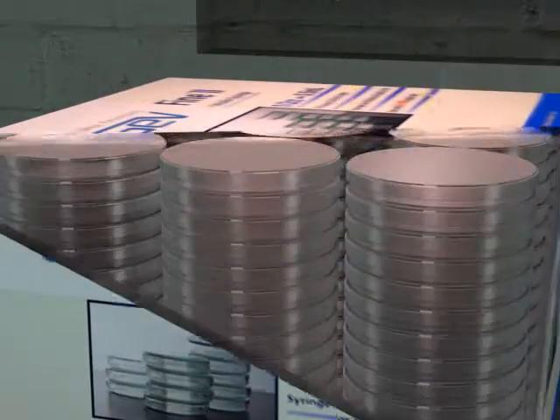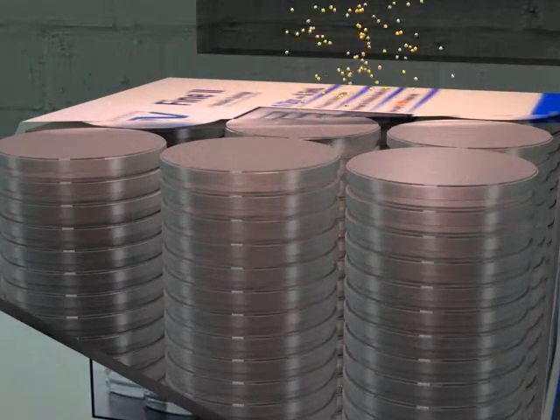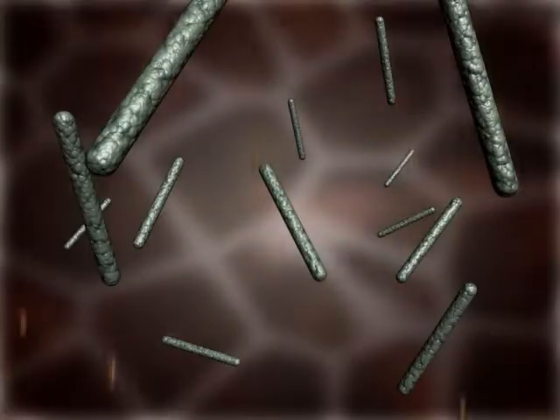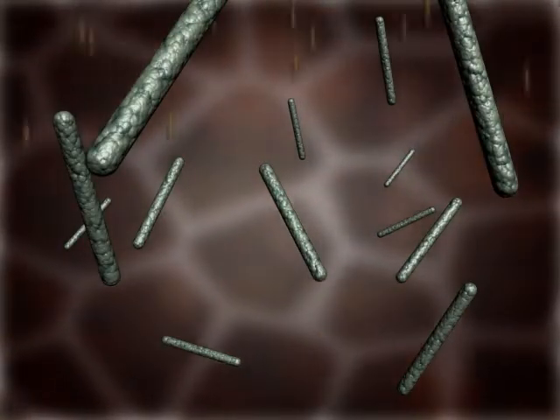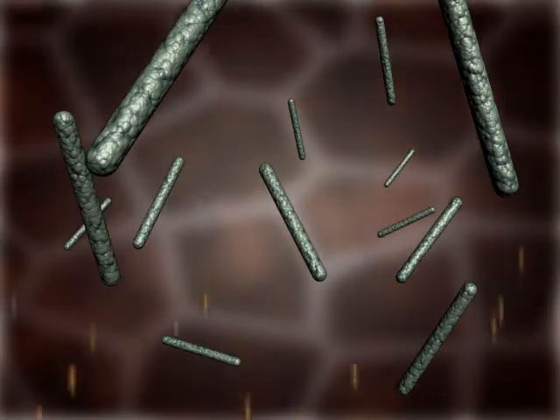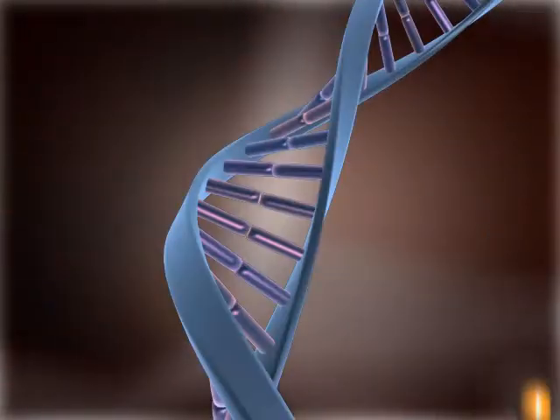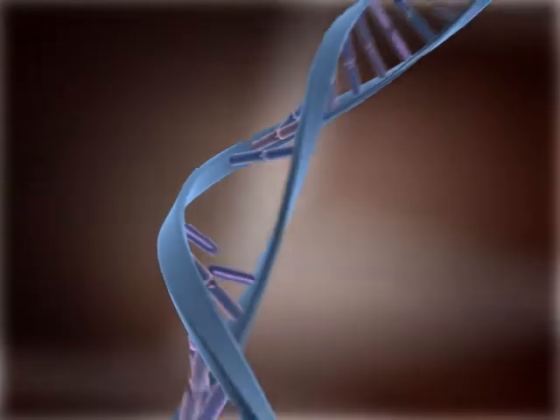Here, electron particles from the electron beam accelerator are being sprayed into the material of the product. The particles destroy the DNA structures of bacteria or microorganisms embedded on the surface or inside the product, thus quickly and effectively exterminating toxic substances.